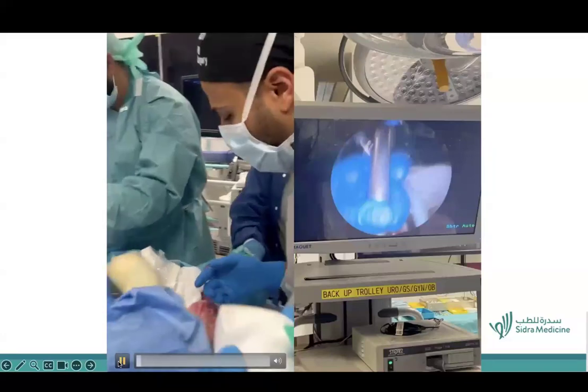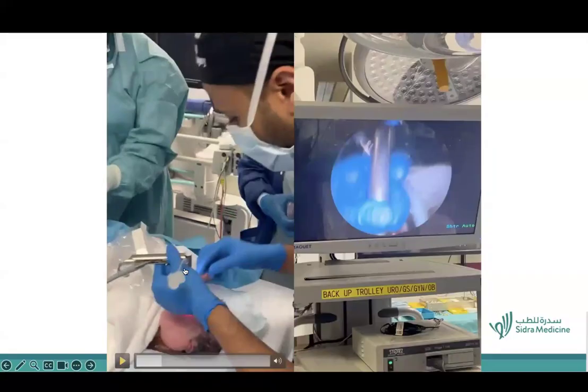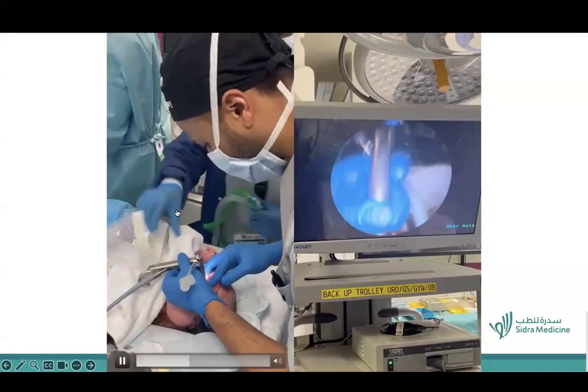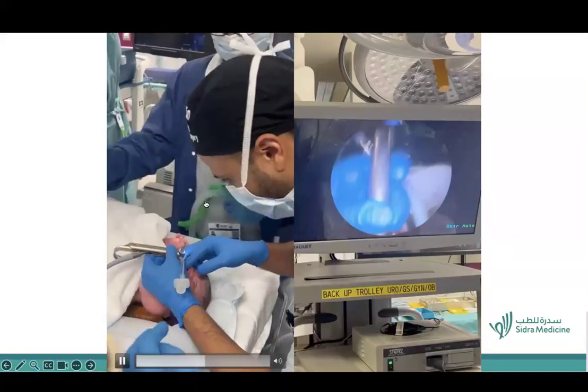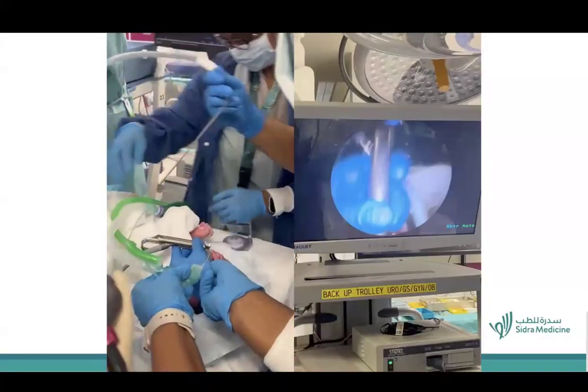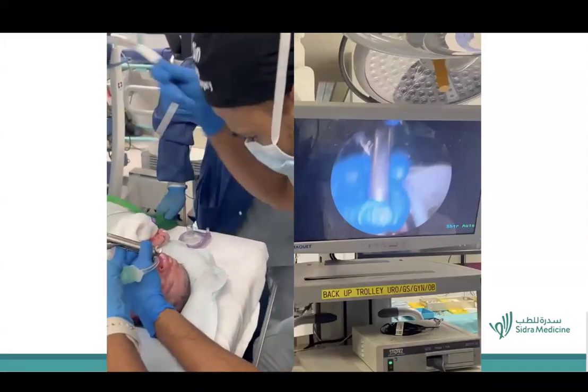What I wanted to show first is the equipment that we have. As you can see, I'm starting with the laryngoscope that has an oxygenation port. That's important because it gives you a bit of oxygen and potentially some time as you're finding and securing the airway. Remember these patients, there's the anesthesiologist here that's working with me, but she has no line access. This patient has just been born, so this patient is almost basically wide awake.